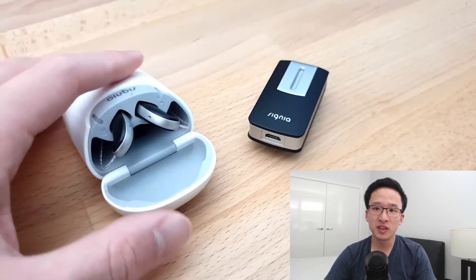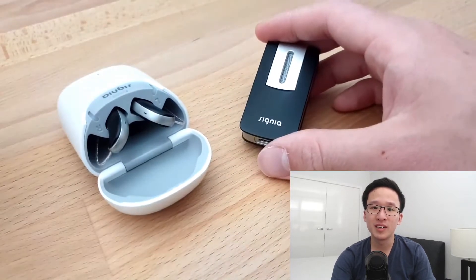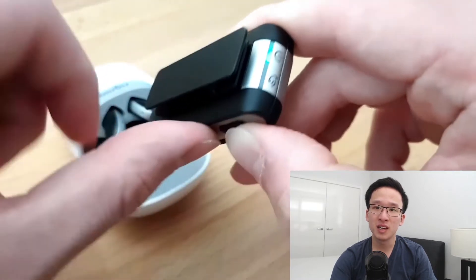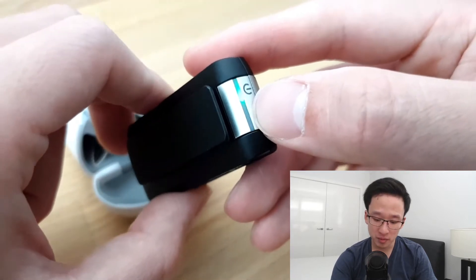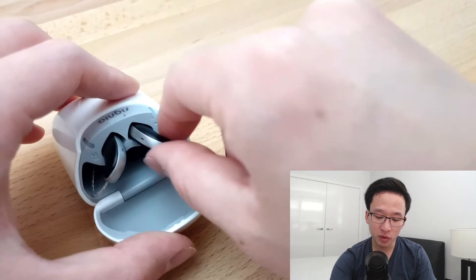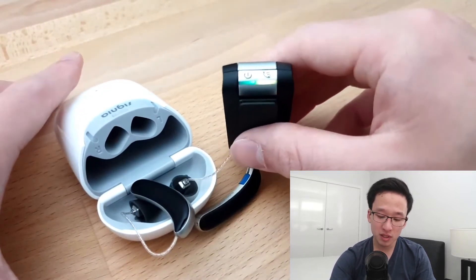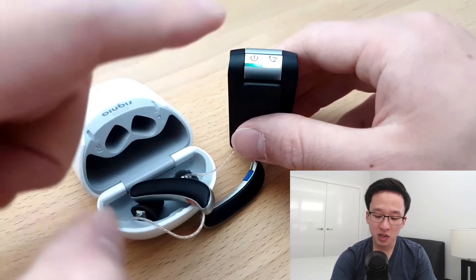Firstly, I wanted to show you how to get your Signia hearing aids connected to your Streamline Mic. What you want to do is turn on the Streamline Mic by holding the multi-function button — it's the biggest button on the side — and you will see that the green light turns on and the yellow light starts blinking. This means the Streamline Mic is looking for hearing aids. Take your hearing aids out of the case and wait a few seconds, and you will see that the blinking stops, meaning your hearing aids have now connected with your Streamline Mic.